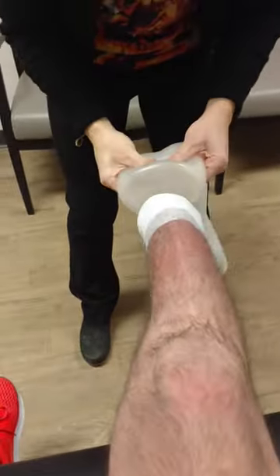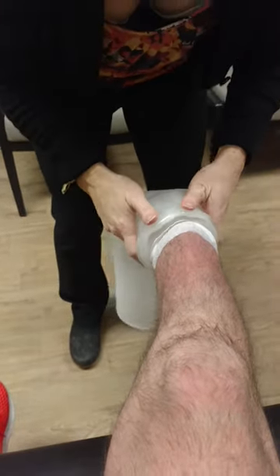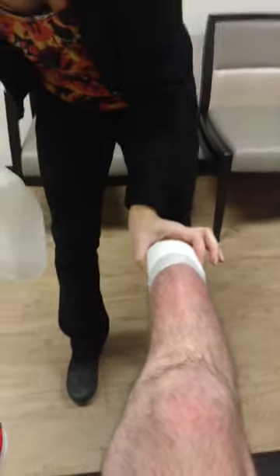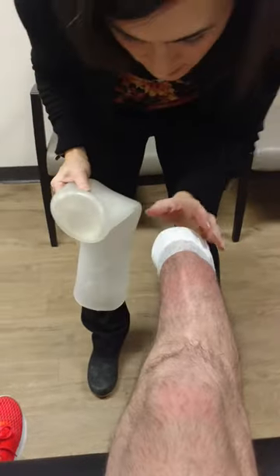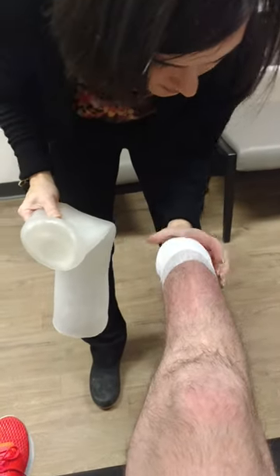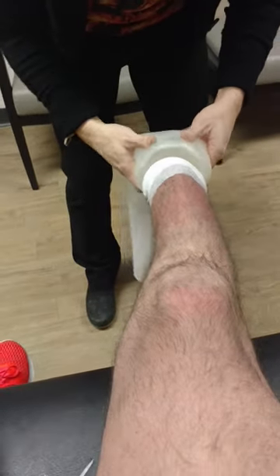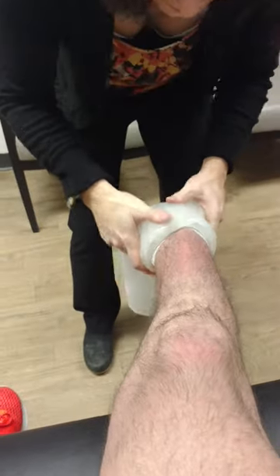You still pinch this flat. Should I have that gauze and tape on there, like since I do it every day, or should I actually take it off? I think we're going to leave it. I mean, I know that it's there and when I modify it, I can take a little more off right there — I'd like to get to the point where I'm taking it off. I think it's fine for now, it's not going to make or break our fit.